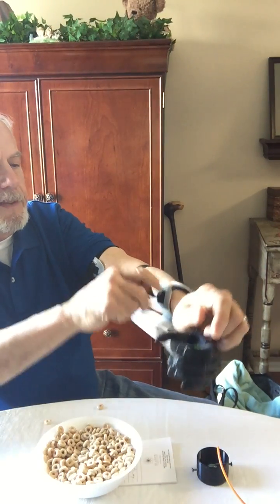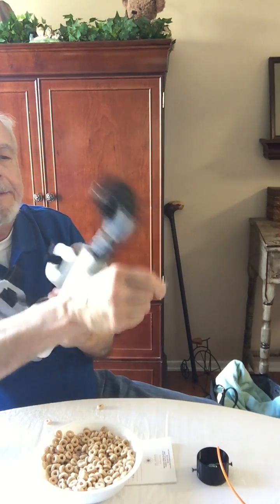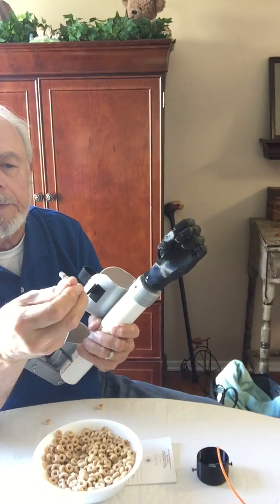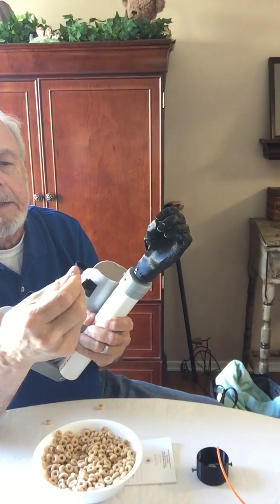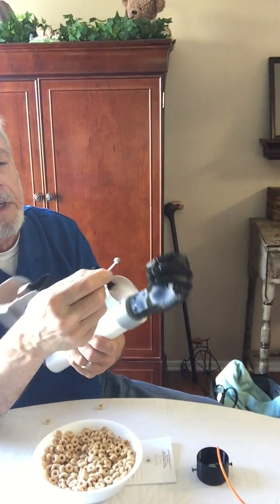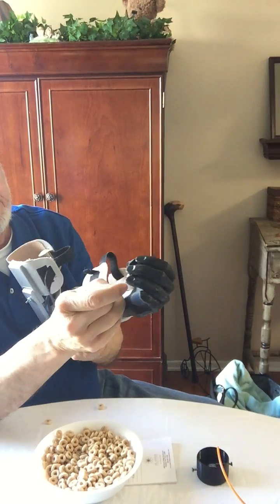So basically, I know we've got a busy agenda today, and I'll just show you a couple of things about how it's connected. There's a Bowden tube, a Bowden cable with a little ball on the end. We print this ball and we use a nylon filament like a weed whacker filament, 1.75 millimeter nylon filament that you might be using on your printer. That makes a great Bowden cable, and you just put the little ball on the end of it and melt the tip of the nylon with a soldering iron. And by the way, when you put things together with rivets made from plastic rods like filament, you can use a soldering iron to flatten out a rivet head on those.